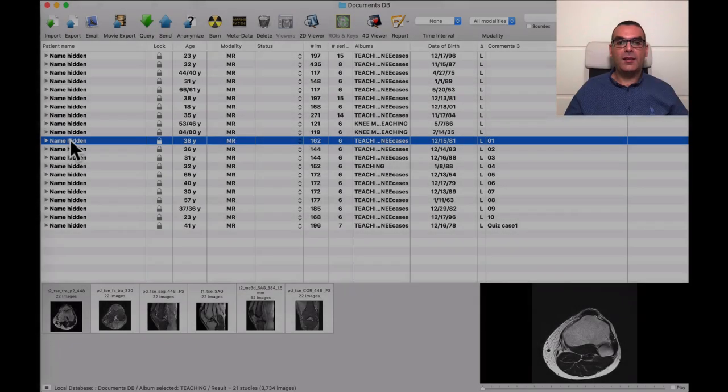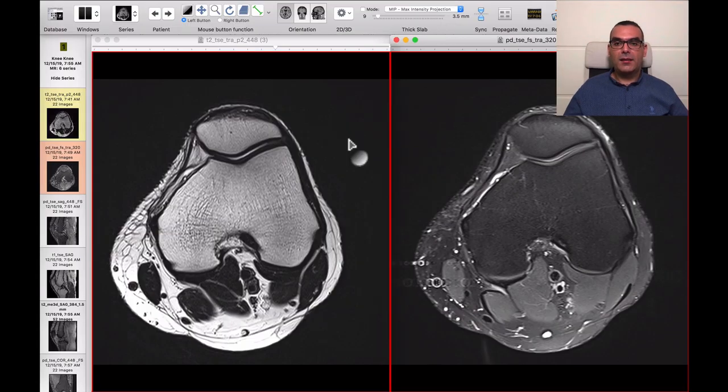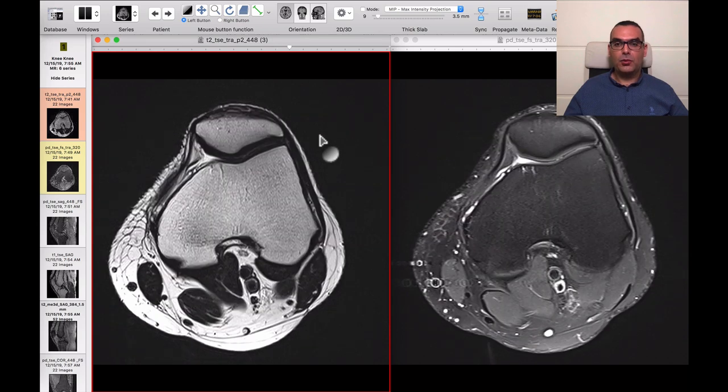Hello everybody and welcome again to the Expert Art Radiology channel. This is Dr. Tamir Gawish. Hope you enjoyed the last video. In this video we'll begin examining real cases. We will scroll through the whole case and then see how to write a well-structured report. Let's get started right away with the first case.